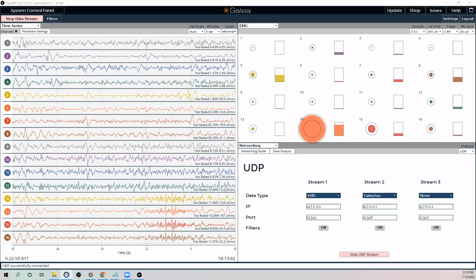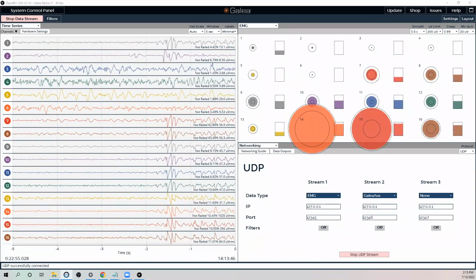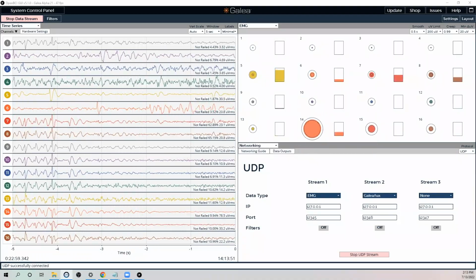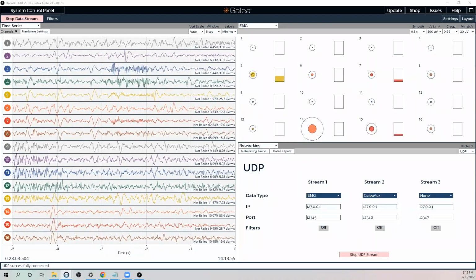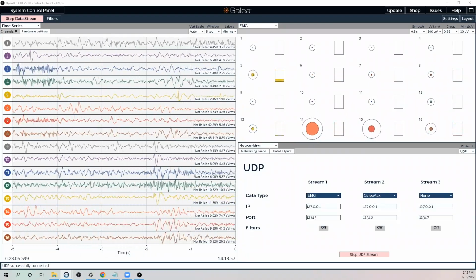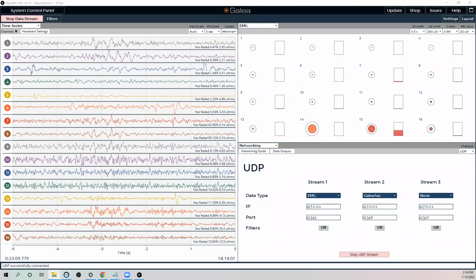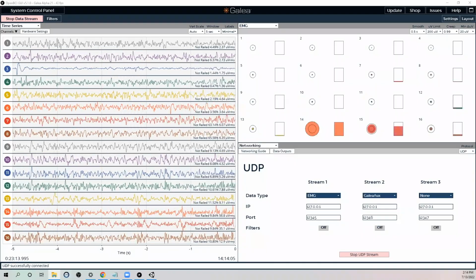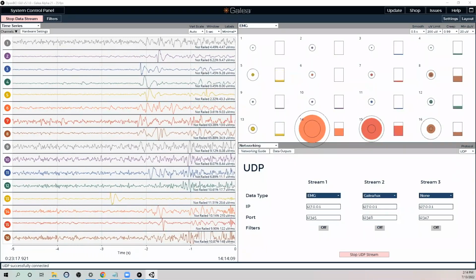The image-based, camera-based eye tracking will be part of the Varjo Aero. It'll be part of the VR headset. So that data stream will come through the Varjo SDK and their own software for making that available. It's not going to be part of the Galea GUI at the moment. They have excellent documentation on that.